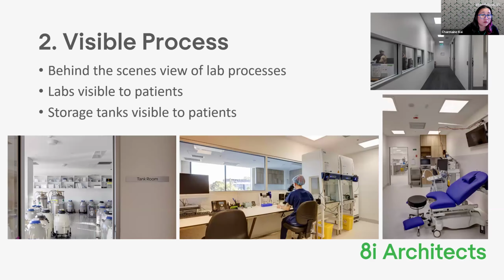So to go on from that, we have a look at the visible process. This is one area where we're trying to break down those barriers for patients, so that they can actually see a little bit of the behind the scenes of the lab processes. A lot of the labs that we do now, the patients can either see into the lab or into the tank room, where they feel a little bit more connected to the process rather than being disengaged.